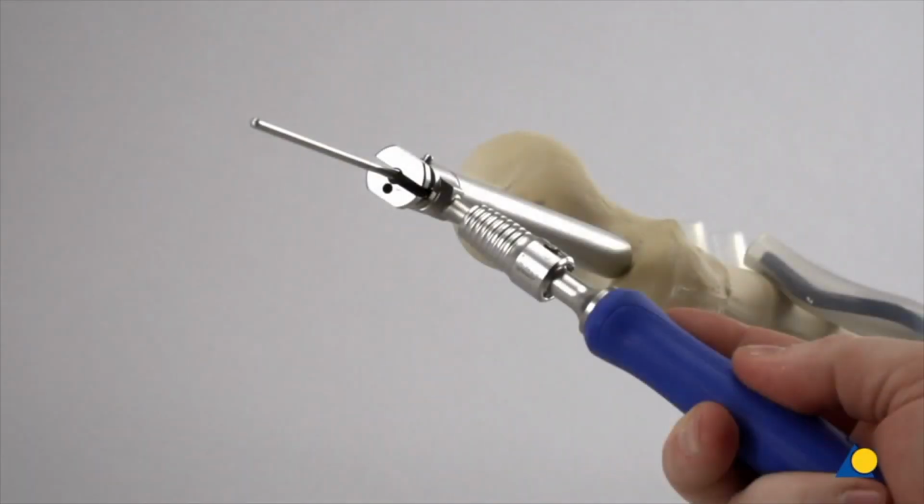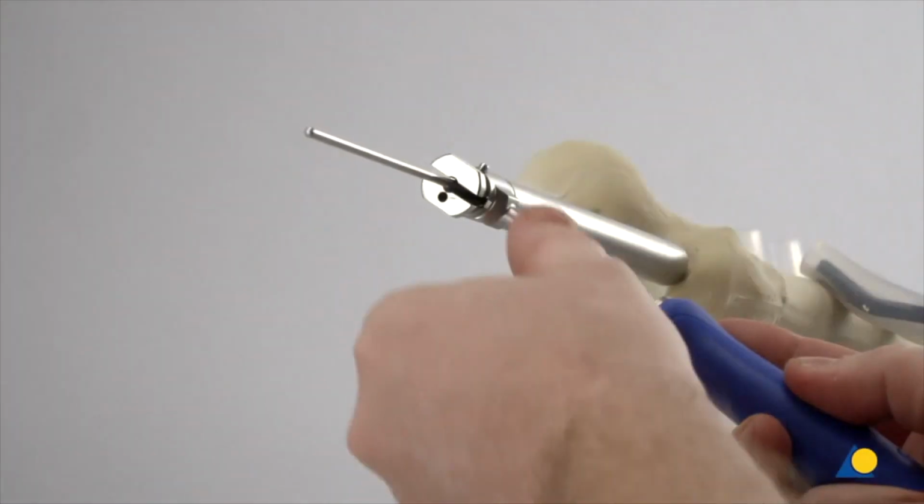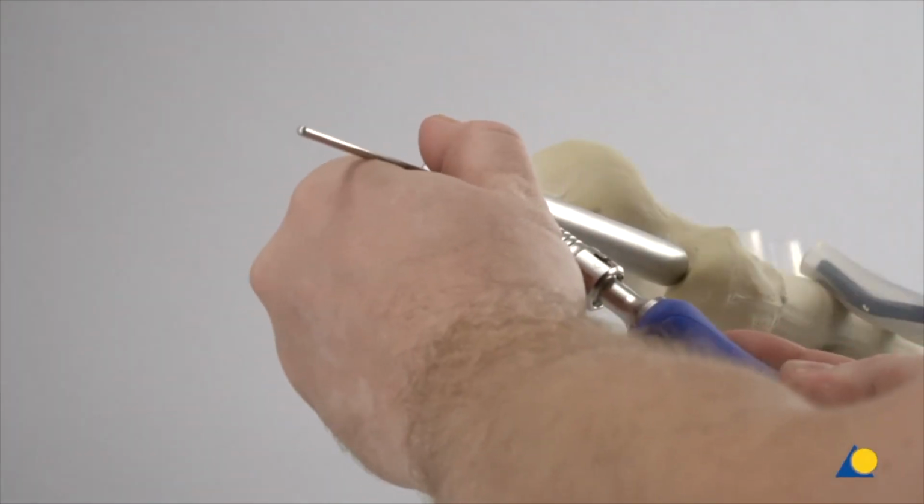The multi-hole drill guide can also be used to correct a misplaced guide wire. To do this, the drill guide is inserted over the first incorrectly placed guide wire, which is kept in place. A second guide wire is then inserted in the correct position, and the first incorrect guide wire is removed. However, in this presentation, the guide wire is in the correct position. The multi-hole drill sleeve is removed.